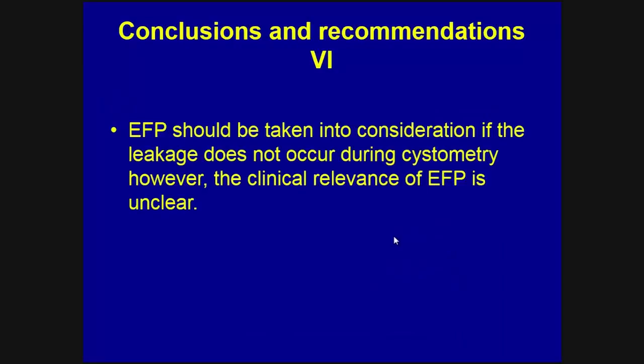End filling pressure should be taken into consideration if the leakage does not occur during cystometry. However, the clinical relevance of EFP is not clear.